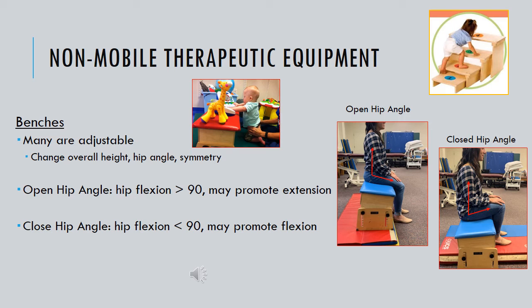You may have a child in standing and their foot is on a lower stool or bench to promote single limb balance. You may use benches as part of an obstacle course where a child has to climb over or creep under. So there are many different applications for use of benches.